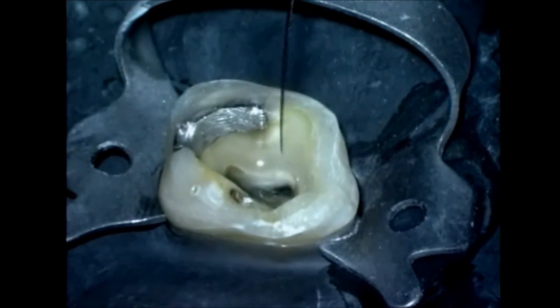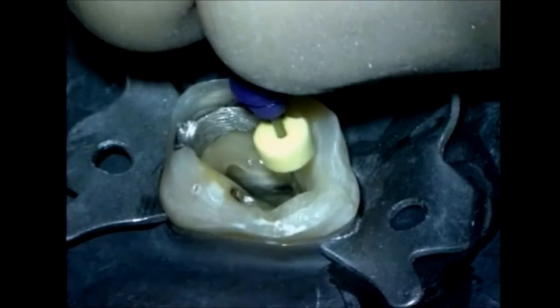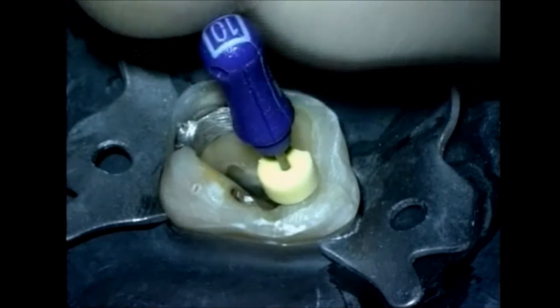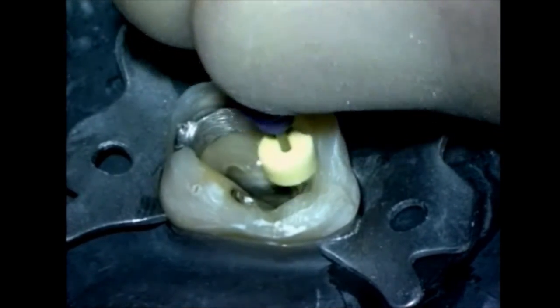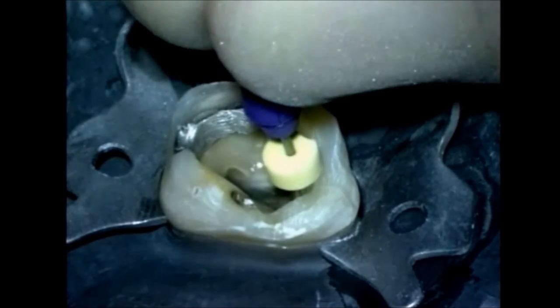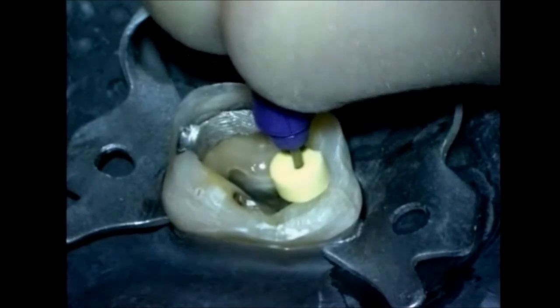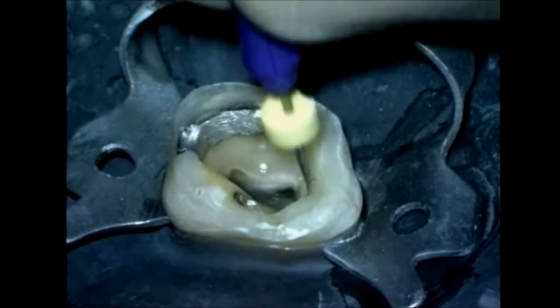Irrigate, recapitulate, and re-irrigate. The 10 file is easily passed through the pre-enlarged canal. A pre-enlarged canal will generally allow the 10 file to slide to length. Once we're at length, stay at length, and carefully and repeatedly explore and refine the glide path. When we have a smooth and reproducible glide path, patency is established. Check the glide path by taking progressively longer strokes.